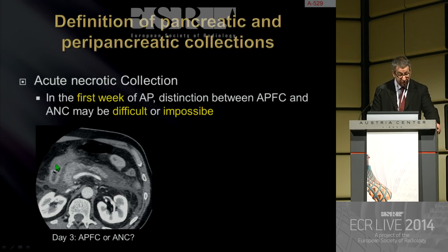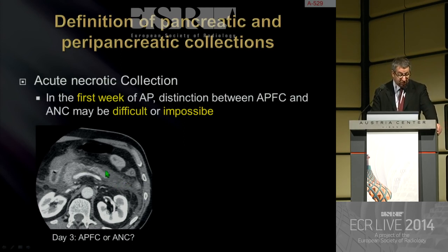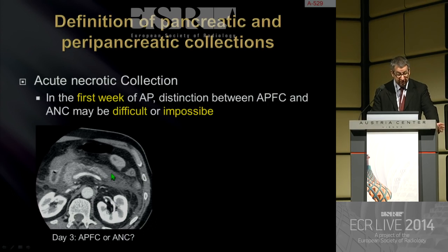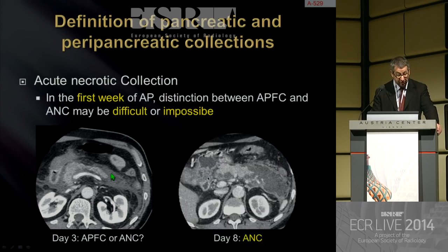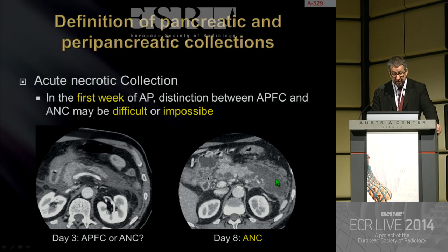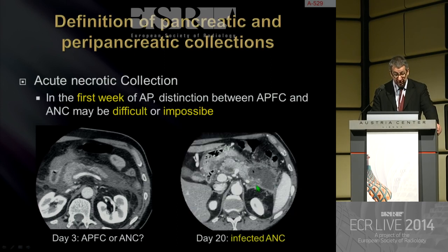In this first example, you have something that looks like APFC — quite homogeneous, low density around the pancreas. It could be acute peripancreatic fluid collection, but it could also be acute necrotic collection, so you have to wait for the next CT. At day three it is ambiguous, but at day eight there is no doubt — it is not APFC; it is an acute necrotic collection, necrotizing pancreatitis. And at day 20, it is infected necrotizing pancreatitis due to the presence of gas.